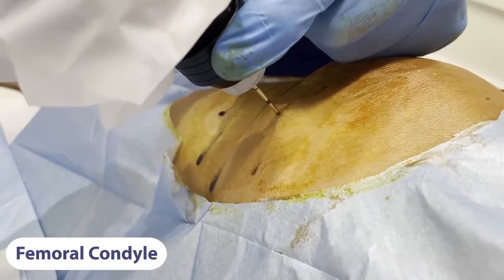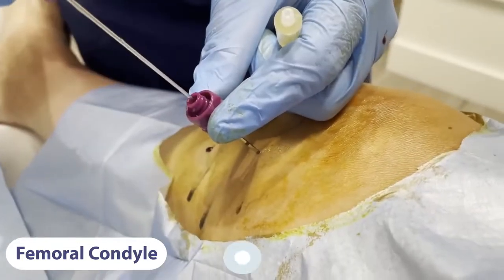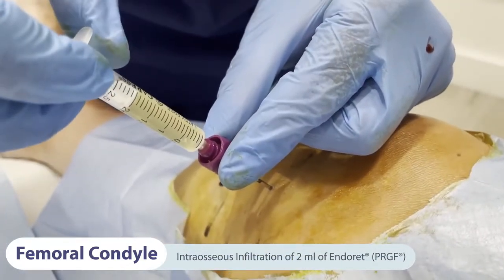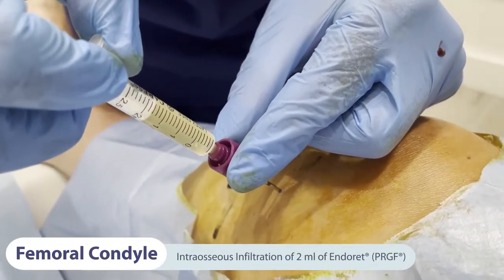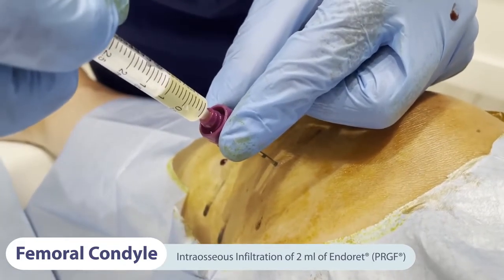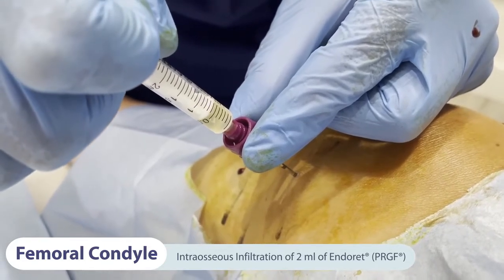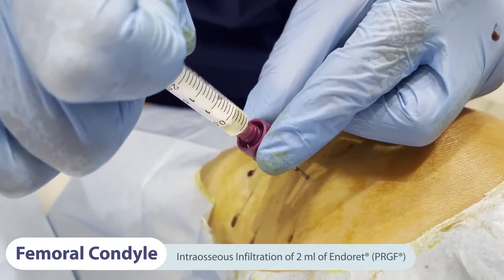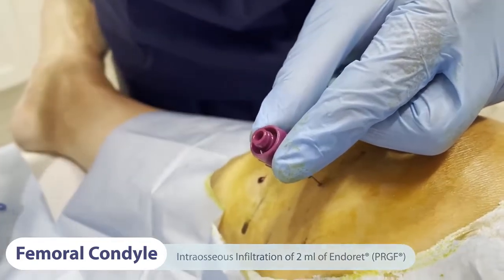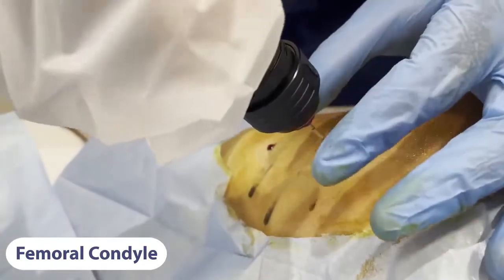Next, the power driver is removed and the needle core extracted. Then 2 millilitres of recently activated PRGF fraction 2 is infiltrated gradually through the trocar. After inserting the needle core back into the trocar and adjusting it to the power driver, the trocar is extracted.